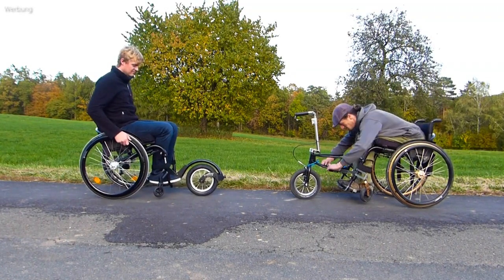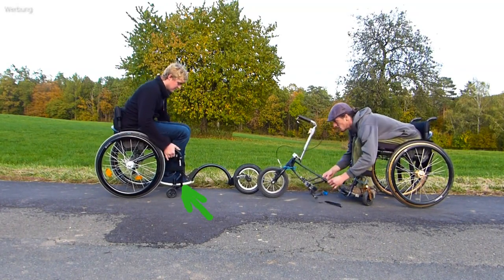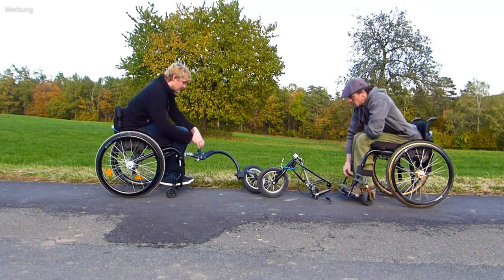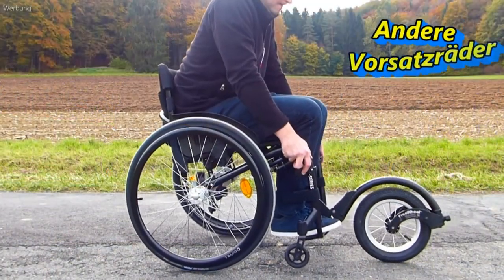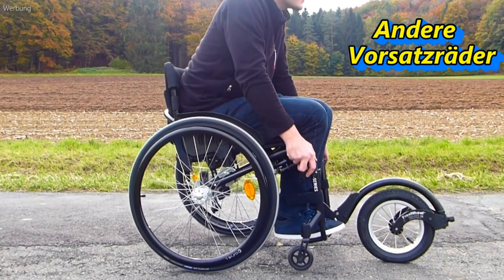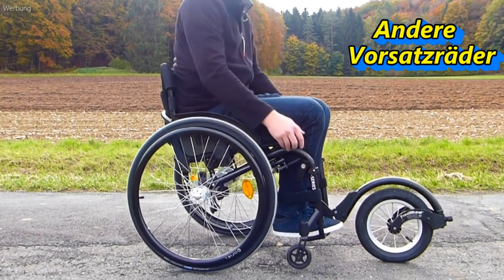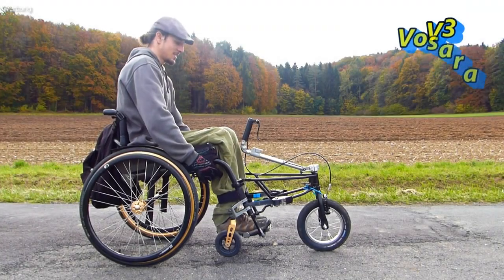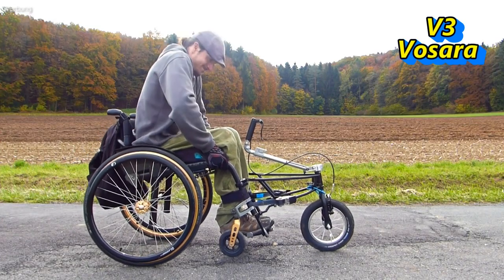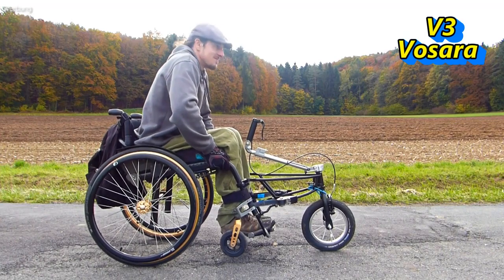Other attachment wheels are connected to the footboard, which is not designed to take such a load. Even with little shift in weight, the wheelchair frame begins to twist. The Fossara is attached to the front tubes of the wheelchair, like a handbike, which significantly increases stability.